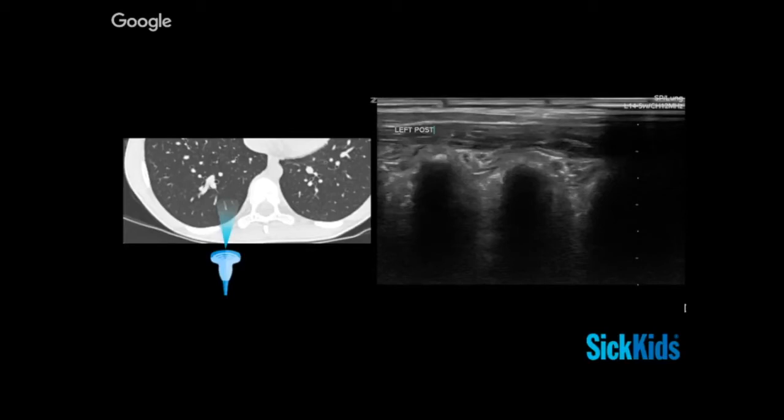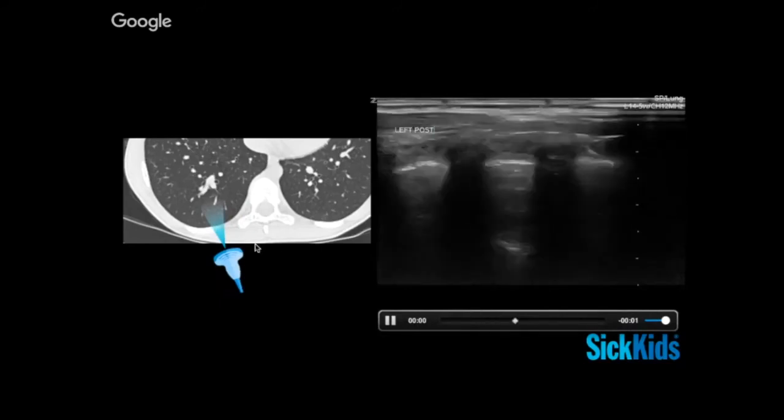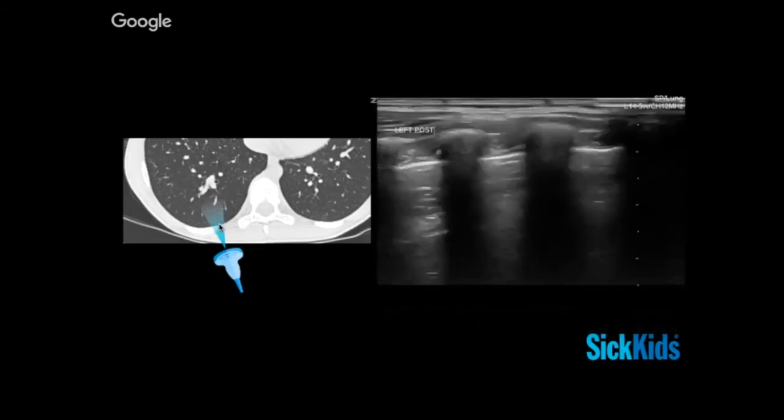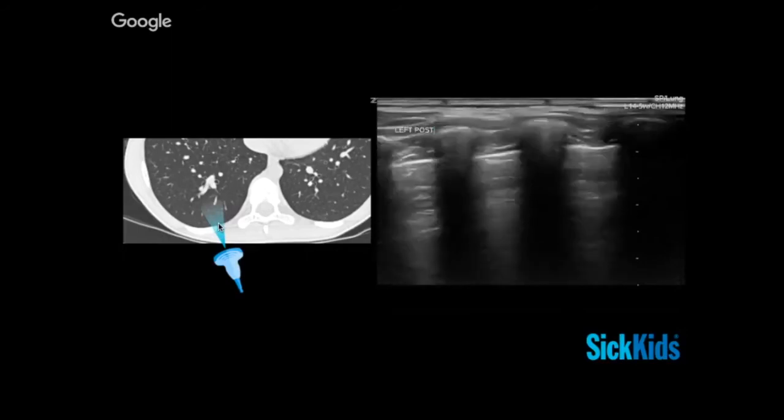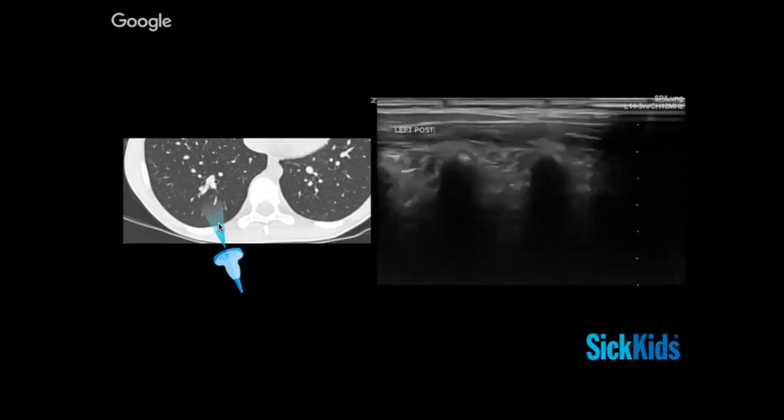When scanning at the back, people often keep their probe aligned longitudinally on the skin, hitting the skin perpendicularly — but underneath the skin you've got the curvature of the lung. If you keep the probe in a direct PA-view angle, the image won't look sharp. If you turn the probe a little obliquely, it sharpens up because you're intersecting the chest angle perpendicularly, not just the skin. So at the back, if it doesn't look sharp, turn the probe obliquely and laterally toward the patient — shoot from their back toward the point of their shoulder.